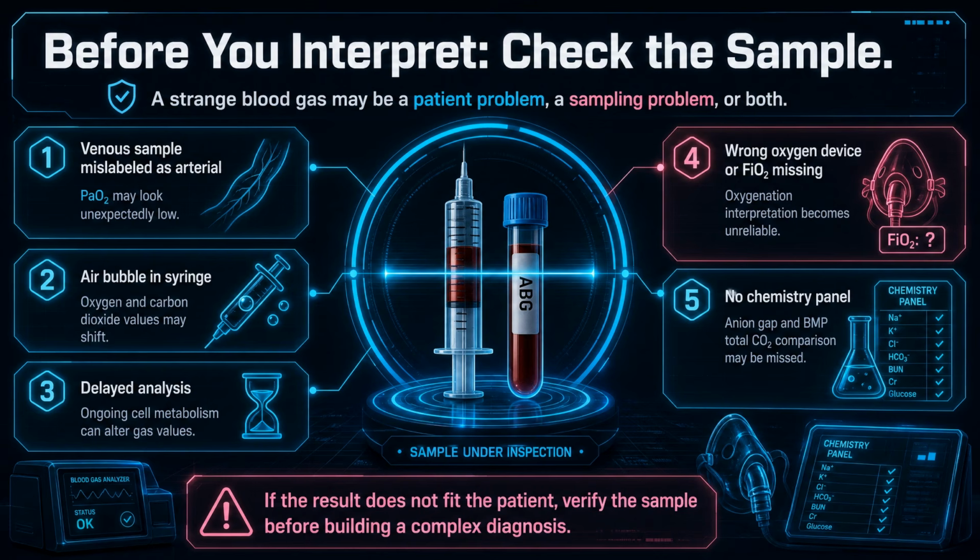Before creating a complex diagnosis, ask whether the sample is believable. A venous sample mislabeled as arterial can make the oxygen tension look unexpectedly low. An air bubble can distort oxygen and carbon dioxide. A delayed analysis can allow ongoing cell metabolism to change values. If the oxygen device or fraction of inspired oxygen is not documented, oxygenation interpretation becomes weak. And without a chemistry panel, you may miss the anion gap or the comparison between gas bicarbonate and total carbon dioxide. If the result does not fit the patient, verify the sample first.